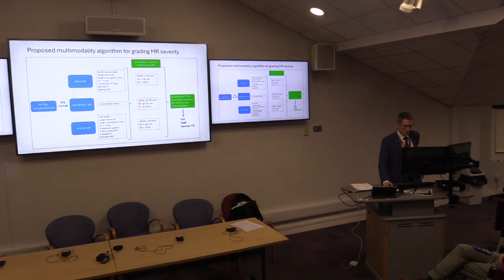And if they're good quality pictures, often we can happily be confident that there is severe mitral regurgitation if we see presence of a flail, large central jet, vena contracta more than 7, high forward flow velocity with E-dominant pattern, systolic flow reversal if you're lucky enough to be able to get pulmonary vein seen on a transthoracic echo. Not always easy, not in a Birmingham population with a BMI of over 35 on average, and evidence of elevated PA pressures, then you can be confident.